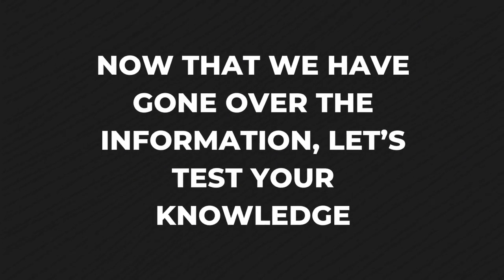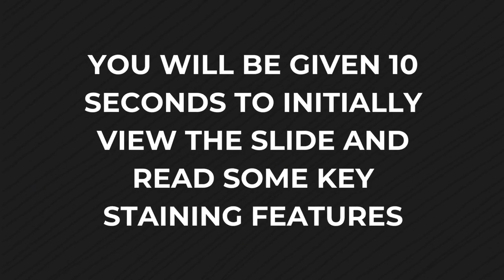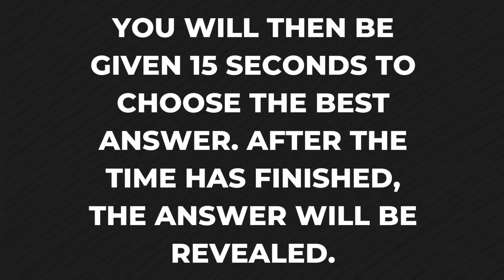Now that we've gone over the information, let's test your knowledge. The next questions will require you to look at a histological slide and answer from the following options. You'll be given 10 seconds to initially view the slide and read some key staining features. You'll then be given 15 seconds to choose the best answer. After the time is finished, the answer will be revealed. Are you ready? Let's go.